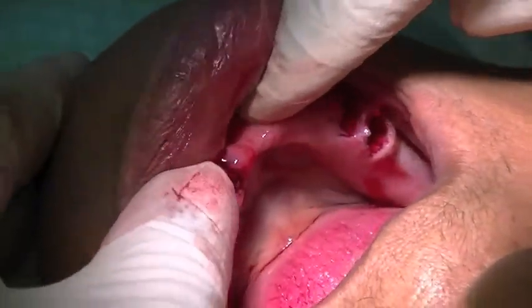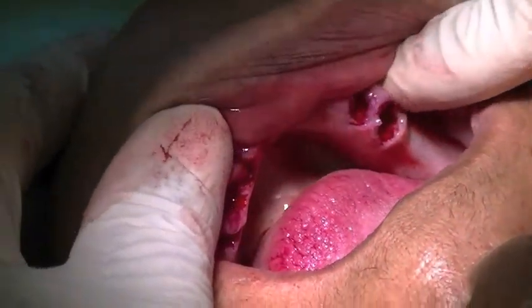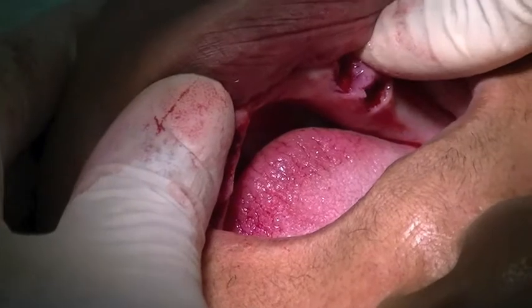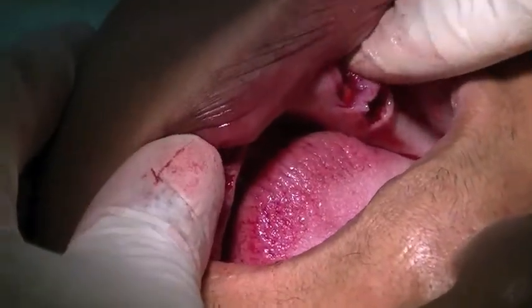We have completed 5 extractions. Lower left, lower right. Everything feels good here. Dude, you've got great bone, man.